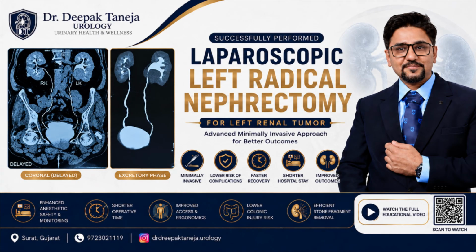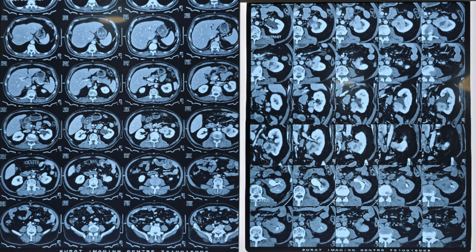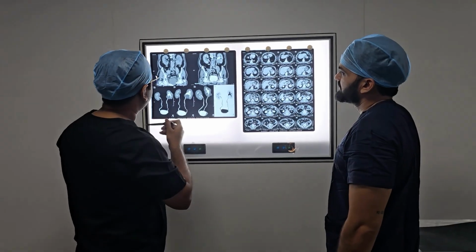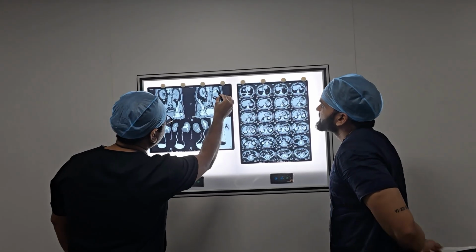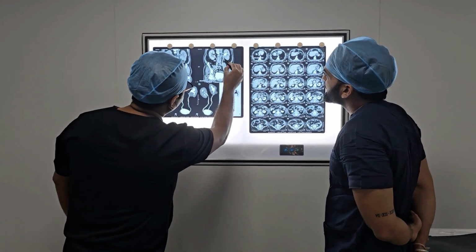Among all the cases that we have seen in our experience, this one is particularly interesting. This patient is a 65-year-old gentleman who is diagnosed incidentally with a left renal mass. This mass is originating at the lower pole of the left kidney.